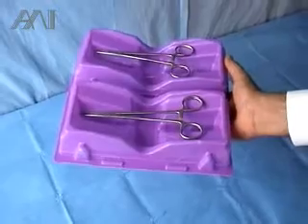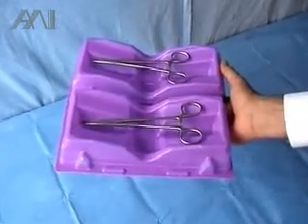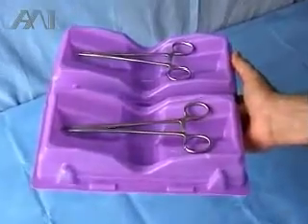This is the safest way in the neutral zone with one hand to exchange needle and needle holders.